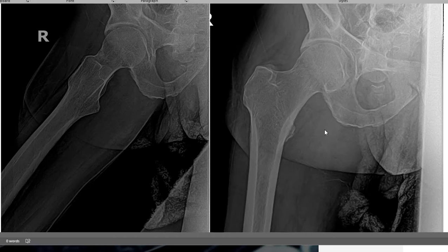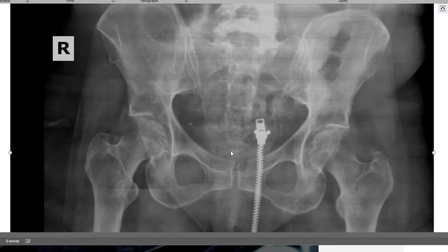Femoral neck fractures are going to occur in this area here. Again, this is a greater trochanter and lesser trochanter, so you'll see an intertrochanteric hip fracture here, and then right here is below the trochanter, so you will see a subtrochanteric hip fracture. So we have subcapital hip fracture at the femoral head-neck junction. We have a femoral neck fracture. We have an intertrochanteric fracture, and we have a subtrochanteric hip fracture. So those are the different words you're going to see in our reports describing those fractures. And again, this is the AP view of the pelvis that goes with that 2 view of the hip.